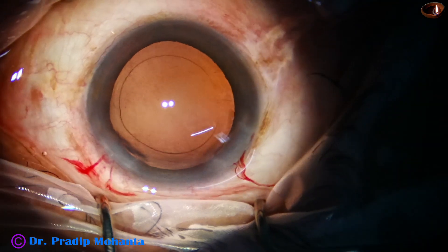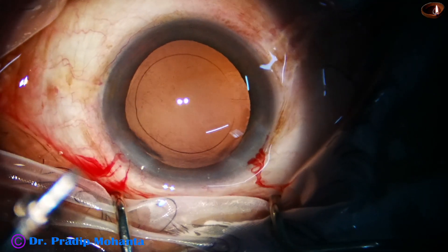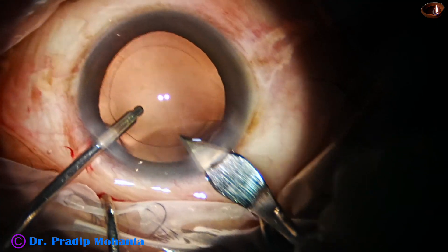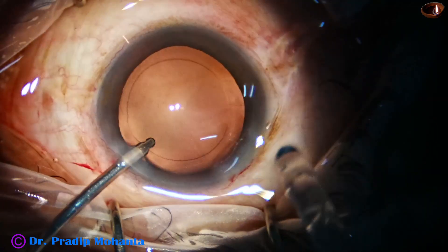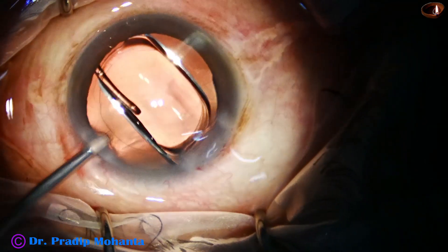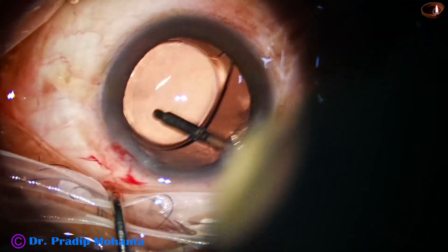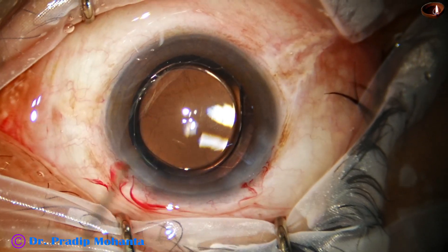Now implantation of the intraocular lens is to be done. This is hydro-implantation, which means the anterior chamber is kept formed by irrigation. The main wound is being enlarged a little bit — the size of the main wound becomes about 3 millimeters — and now with the help of a B cartridge the intraocular lens goes in. The lens is placed in the capsular bag. The irrigating probe goes behind the lens to polish the posterior capsule. Now this is a bit of moxifloxacin.